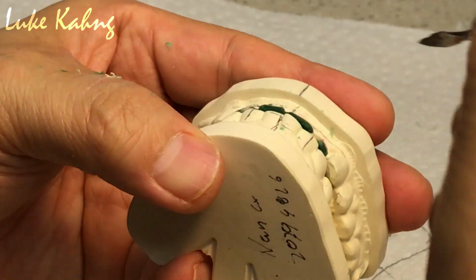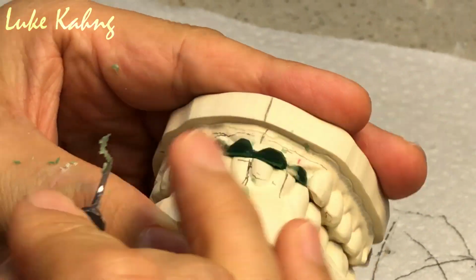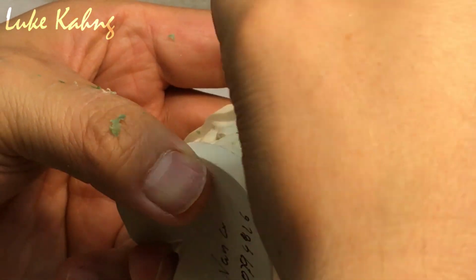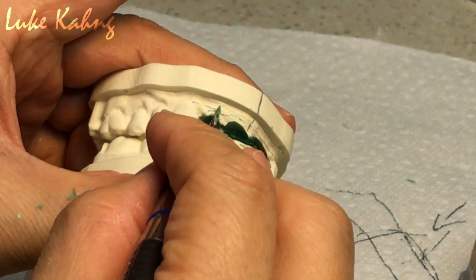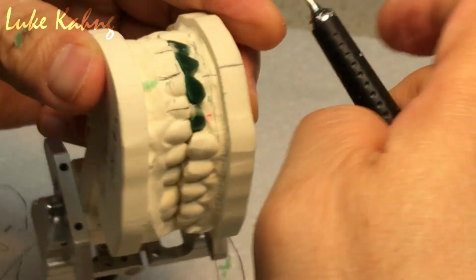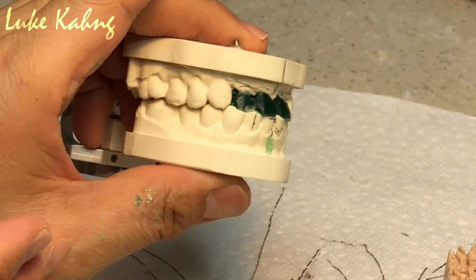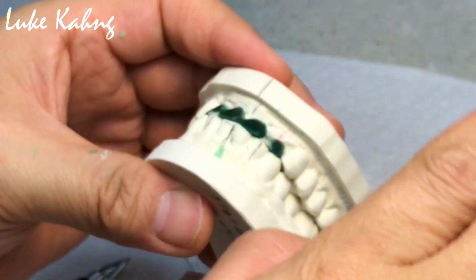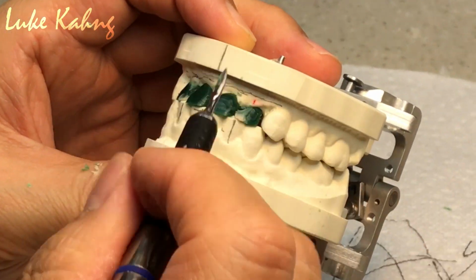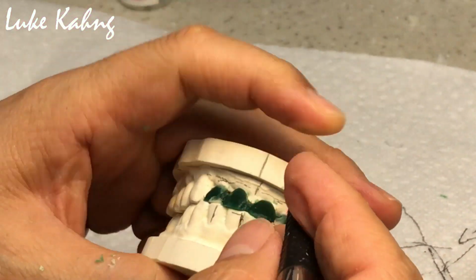So, central occlusion view, I need to trim it a little bit. Can you cut this? This, I don't need this, because this is irritating our eyes. So make the horizontal thing more. Just carbide bar, just trim it. And then you wide open, and you see vertically. If this is a problem. Yeah, this is the base. So I'm gonna take off this. Just like flat. Yeah. Like flat. Okay, so now this one should be okay. This one, cut it a little bit.